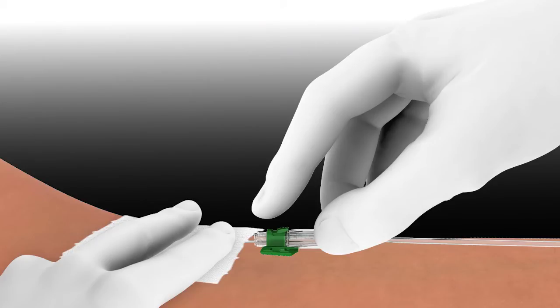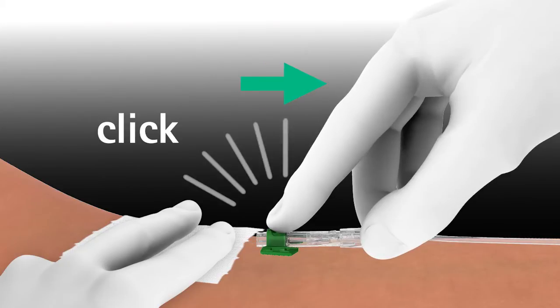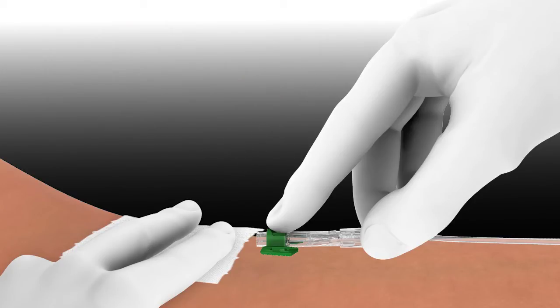Here is how the safety mechanism is activated. Begin by pressing on the button located on top of the device with the index finger. Then pull the hub backwards with the thumb and middle finger until an audible click is heard. The click sound confirms that the needle is completely and permanently retracted.